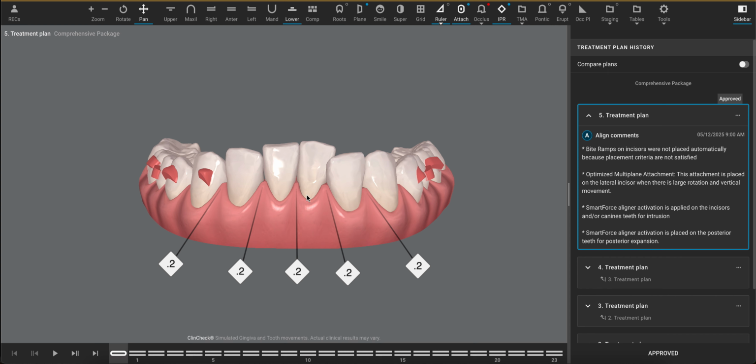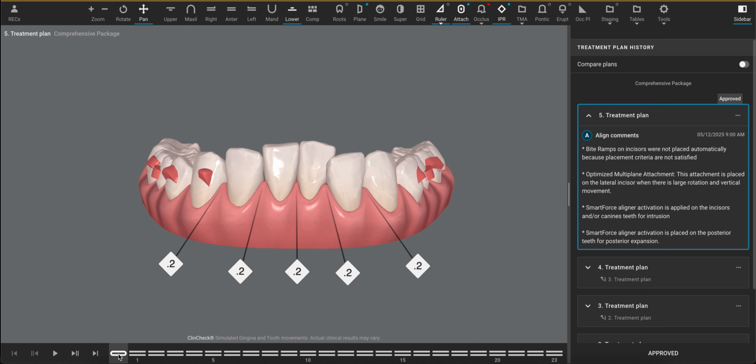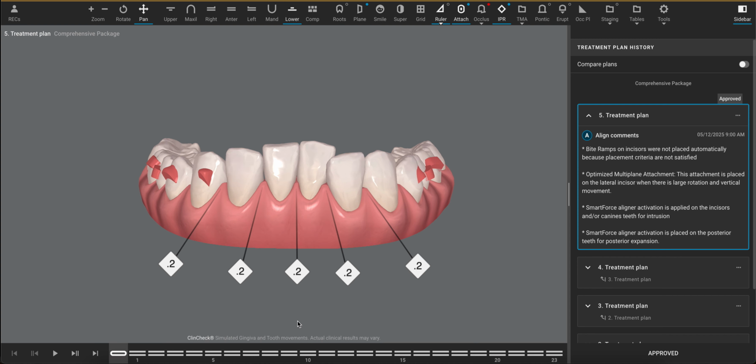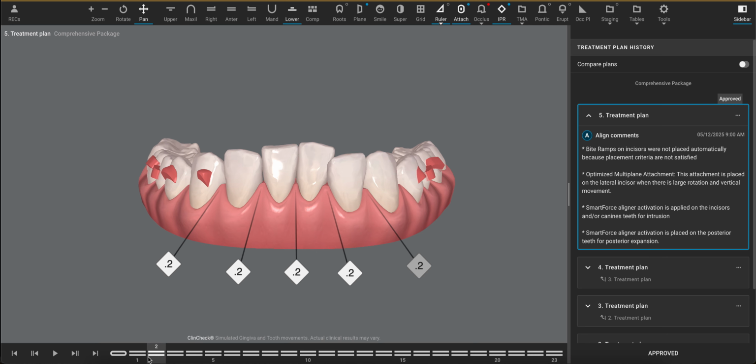So these two teeth, you had said the patient's on tray 9, I believe, which isn't that far into treatment. And to have grade 2 mobility this soon could raise a red flag, and that's why you had brought the question to me. So the first thing I want to know is, I just want to kind of follow the path. Where are these teeth going in relation to the existing alveolar housing?